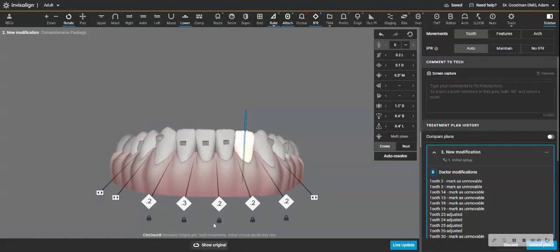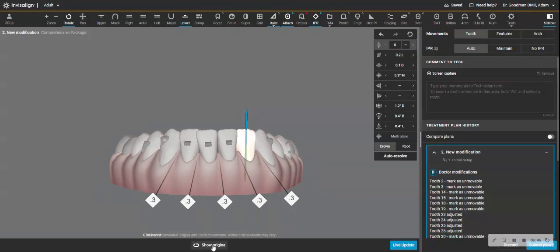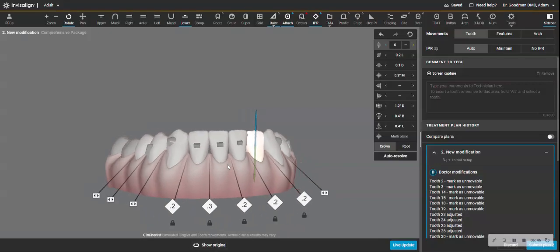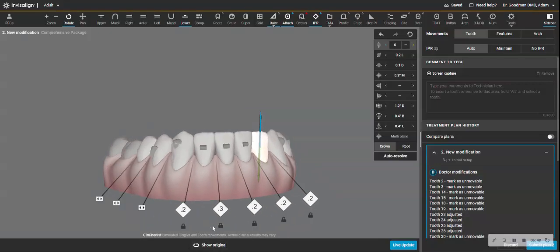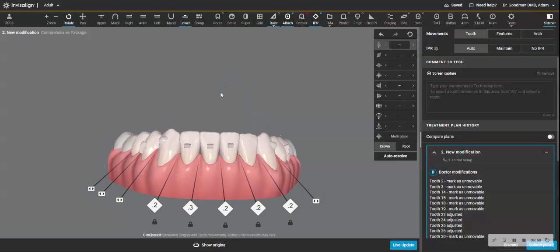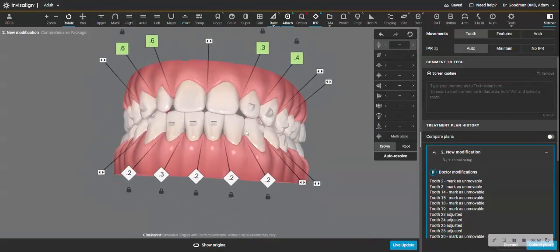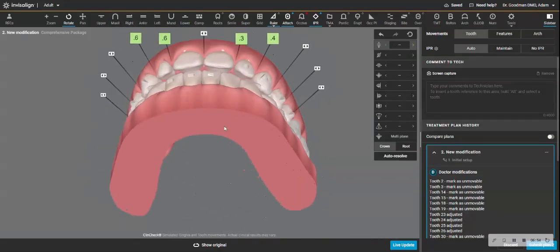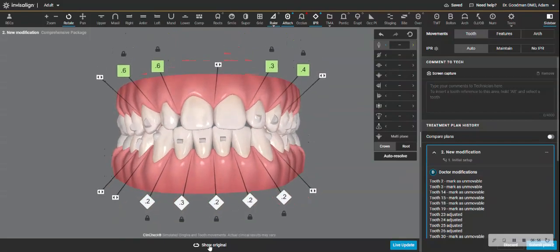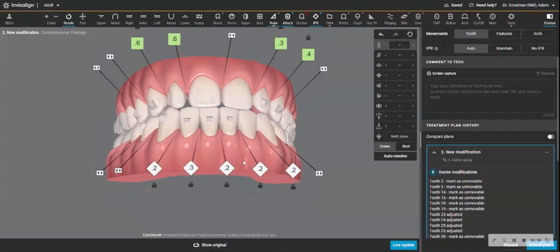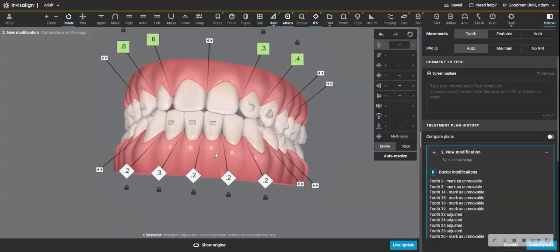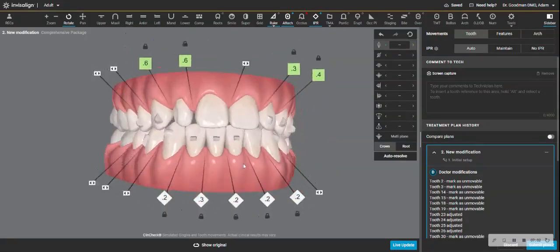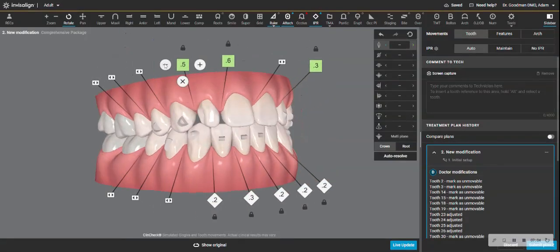And then let's see if my occlusion will still look reasonable. So there's still some extrusion by virtue of the root angulation. But less than there was before. And the occlusion still looks okay anteriorly. If I don't have anterior guidance, I can always back it up a little bit. In fact, maybe what I'll do is make a little bit less space here.